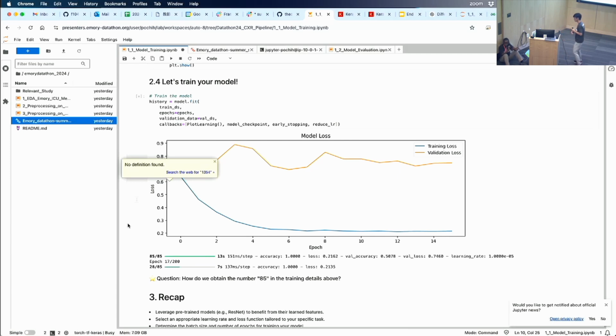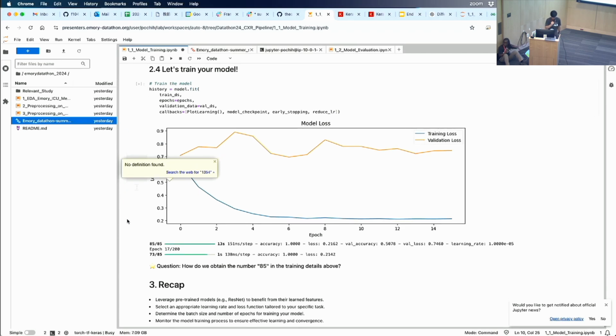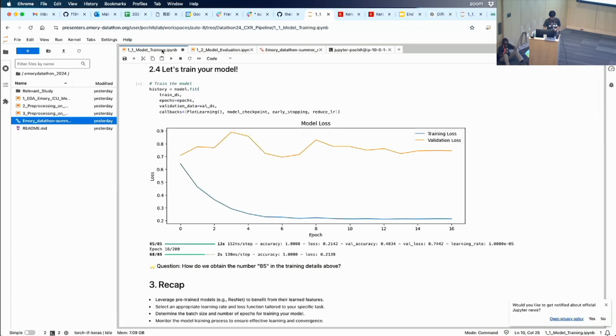So we're moving sequentially. Number one, we started with tabular data to introduce these concepts. Then we transitioned to a little bit of context to process medical imaging data. Then today, we went to ground truths, and what your considerations are. And now we're trying to show you what it takes to build a deep learning model on medical imaging.